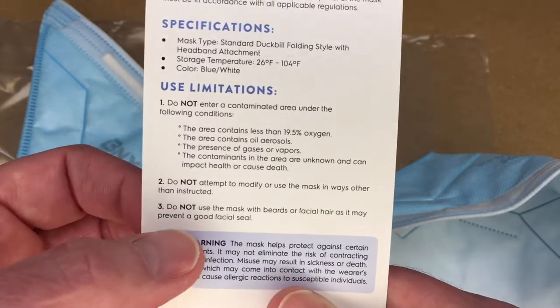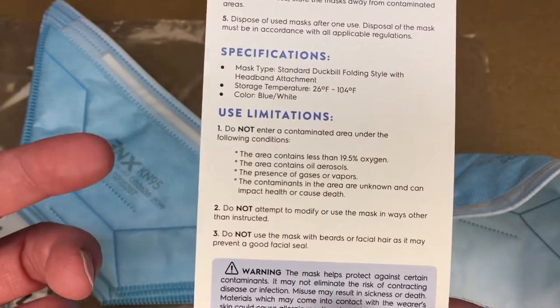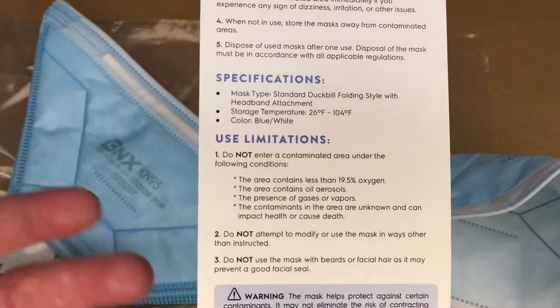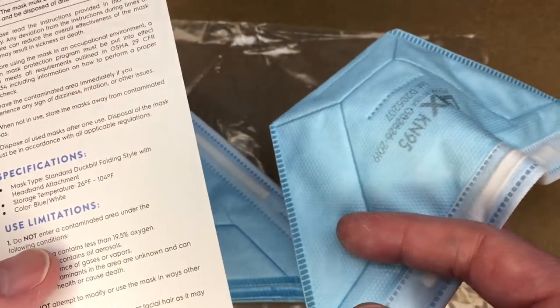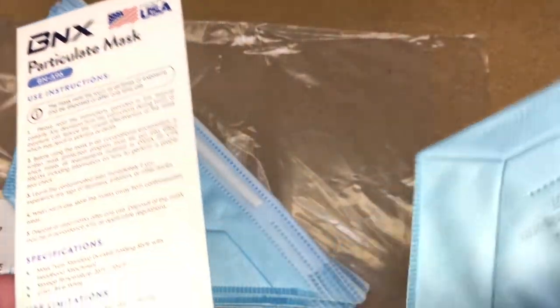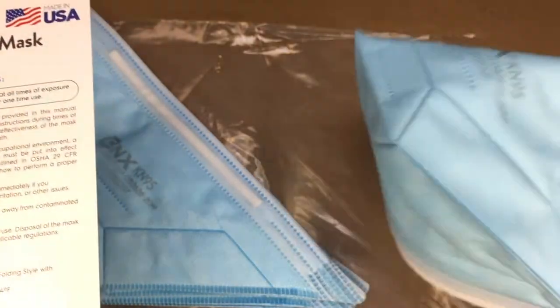It says do not attempt to modify the mask or use it in ways other than instructed, and do not use the mask with beards or facial hair that may prevent a good facial seal. From my personal experience, having a beard and wearing a mask isn't ideal, but I feel it's better than nothing. Similarly, for areas with oil aerosols like spray painting, these aren't the ideal mask, but I'd say something is better than nothing — though you should consider your own health and risks.